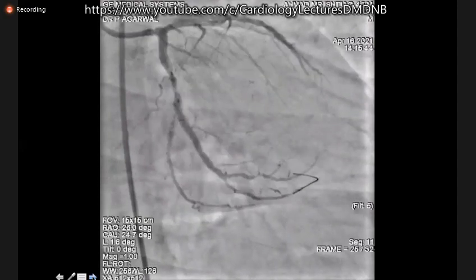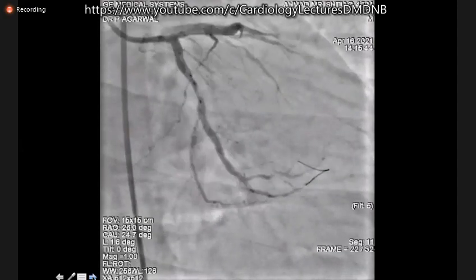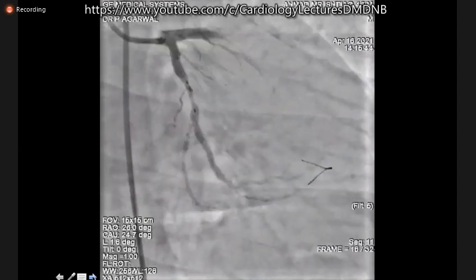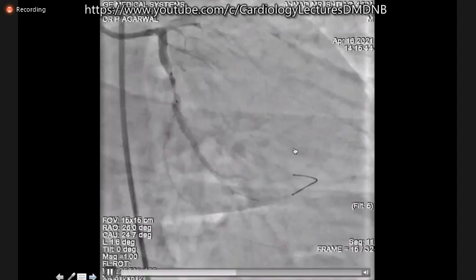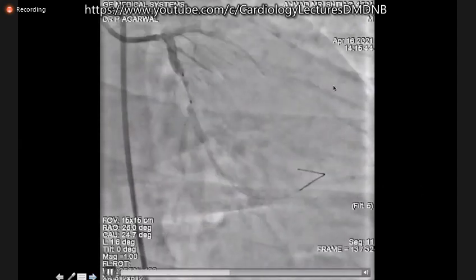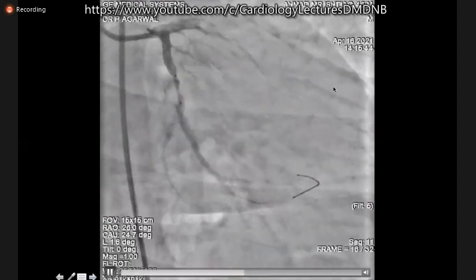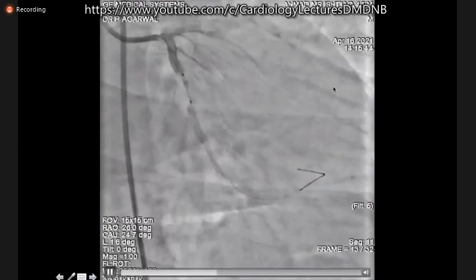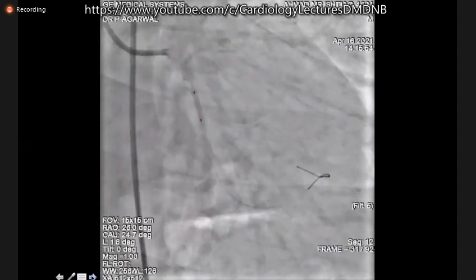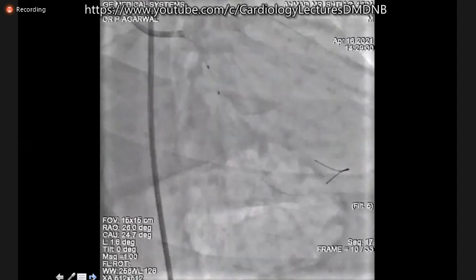So as my usual practice, it's an XB guide and an all-star wire. I am just preparing my lesion for a cutting balloon to go in. So it's a 2.25 balloon to just make the room for a cutting balloon. And now, if we just go to the next one, that's a balloon dilatation, and now comes the cutting balloon.